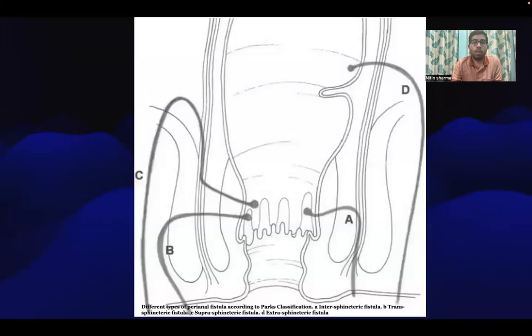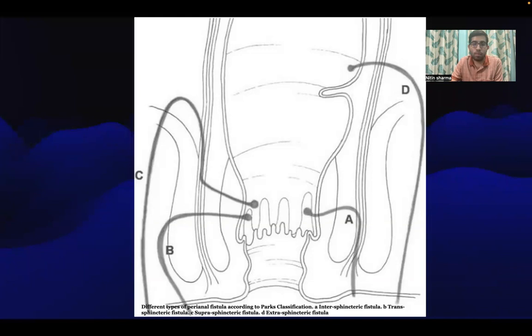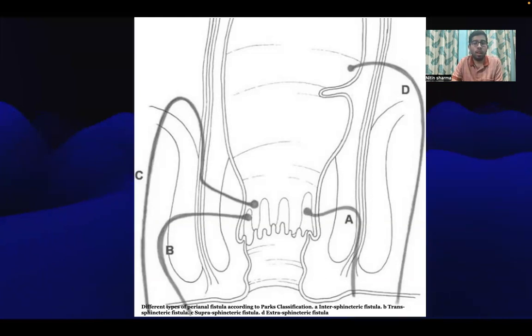This image shows the various types of fistulas using the Park's classification. Type A is the intersphincteric fistula. Type B is the transsphincteric fistula, which crosses both the internal and external sphincter. Then there is the suprasphincteric fistula and the extrasphincteric fistula.